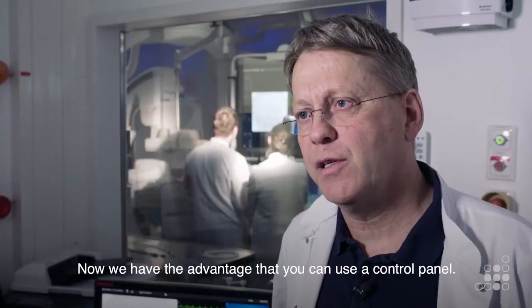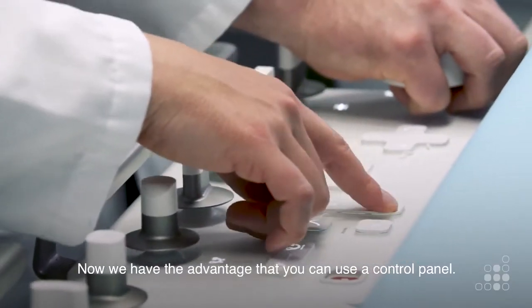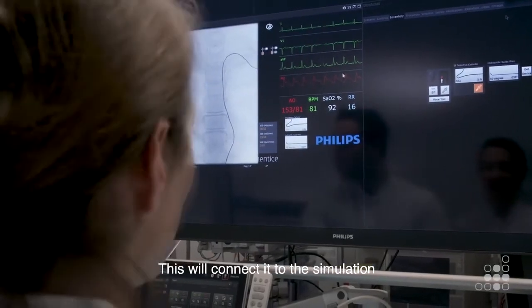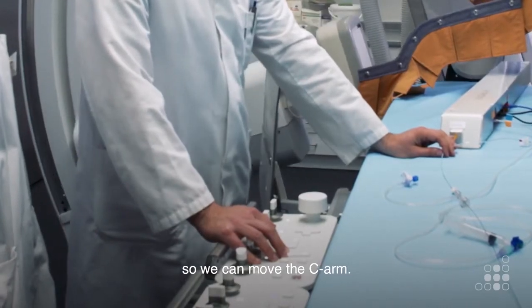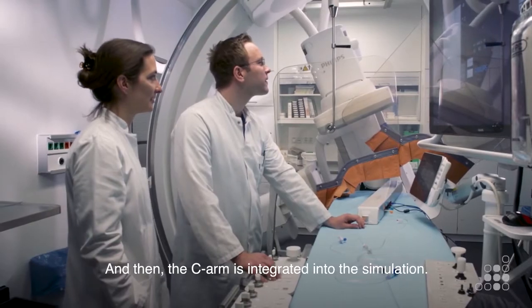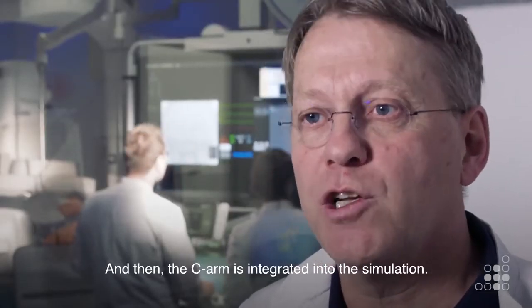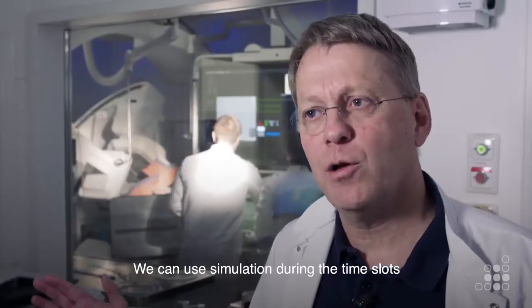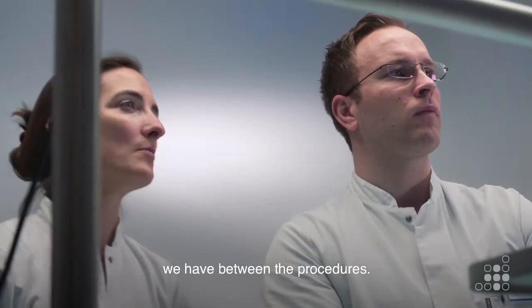Now we have the advantage that we can use a control panel. This connects to the simulation, so we can move the C-arm, and the C-arm is integrated into the simulation. We can use the simulation during the time slots we have between procedures.